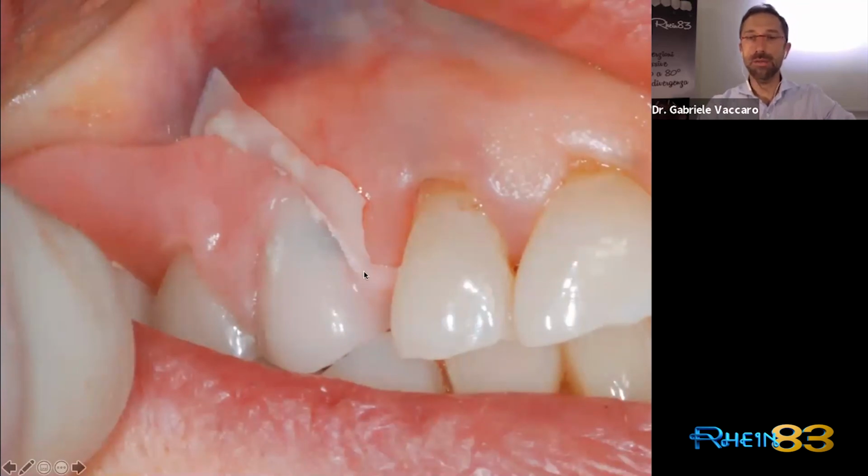The liquid resin will flow out, and we ask the patient to close tightly, because we don't want any alteration of the occlusal plane. And we can also use the patient's sensitivity to be sure that everything is in its place, and we have no friction between the cap and the prosthesis, because this system works well if everything lies on the gingiva, not on the residual root. We always remember that this is a retention system, not a supporting system.